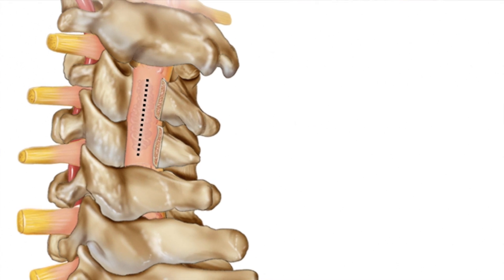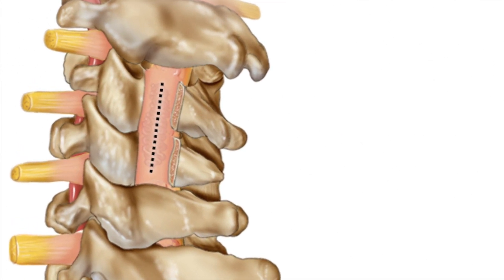In this case, I performed what is termed a hemilaminectomy, where I removed only half of the bone along the back of the neck at the two levels overlying the cavernous malformation at C3 and C4. Opening the dura, or covering of the spinal cord, then allows exposure of small ligaments known as the dentate ligaments, which can be cut and put under gentle traction to twist the spinal cord slightly and bring a ventral lesion such as this cavernous malformation into view. This avoids the need for subsequent spinal instrumentation and hardware and does not put the patient at risk for significant deformity and instability.